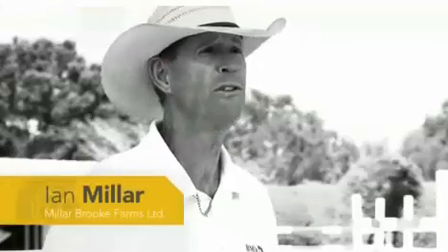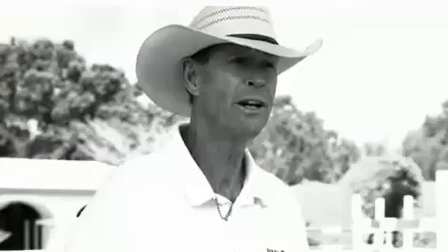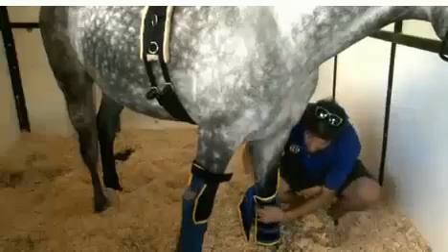The Aureus has been used on every horse in the operation, just as needed. But you can imagine the horses jumping big wide jumps and landing hard are going to be right at the head of the list. And again, get the heat out. If you want to get healing going quickly, get the heat out.